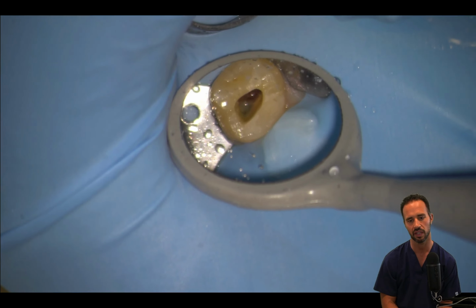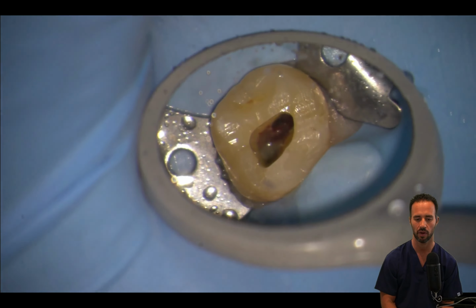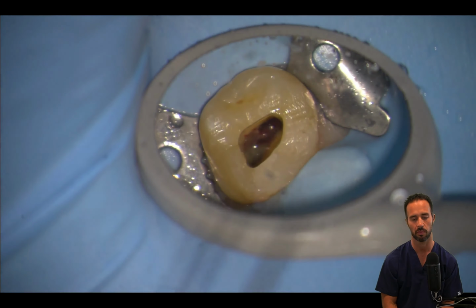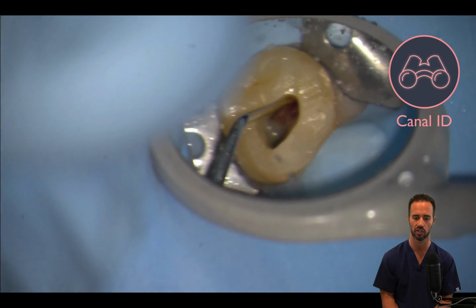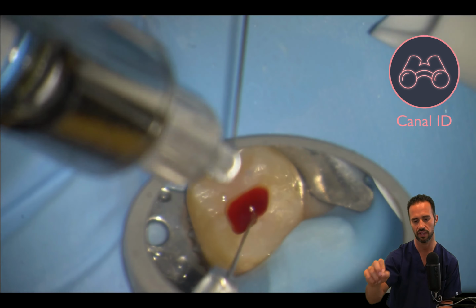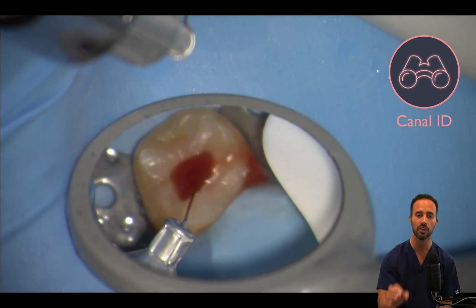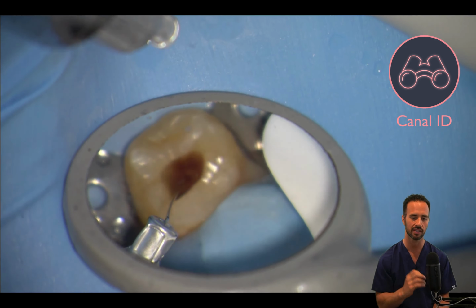There's going to be a little bleeding because we're dealing with vital pulp tissue. In this case, you'll notice shortly that the palatal canal is actually very large. So we've got our endo explorer, and in looking for the canals, our patient felt some pain. So what we're doing is an intrapulpal here, just like we discussed earlier.